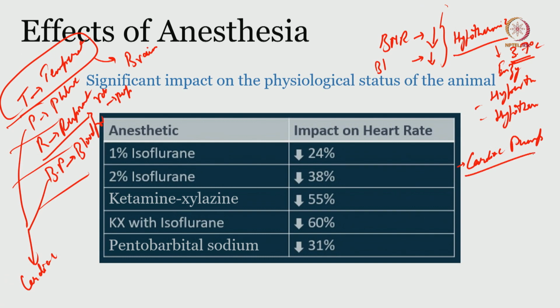So, in a rat, the heart rate range is around 250 to 500 beats per minute. That is a pretty wide range. However, that should be the range wherein you are monitoring the heart rate, with a respiratory rate of around 36 to 50 per minute. Okay, respiratory rate is going to be 36 to 50 per minute.